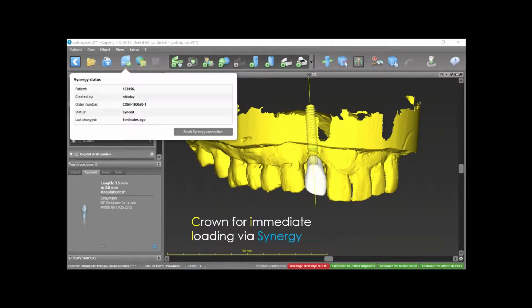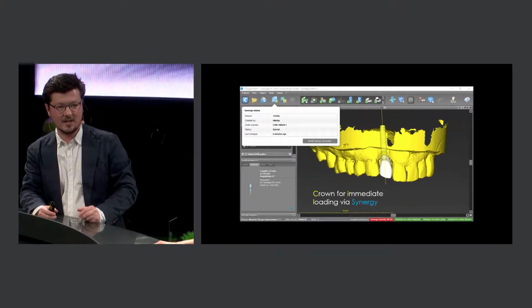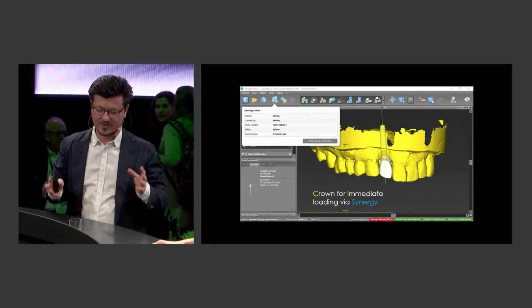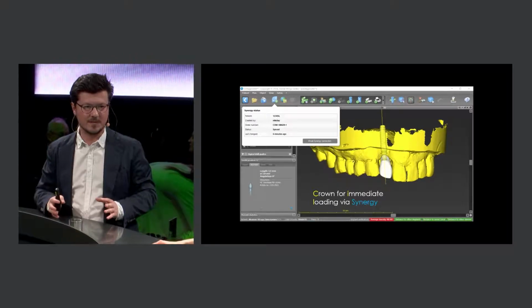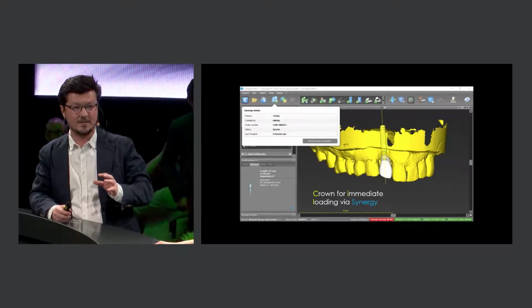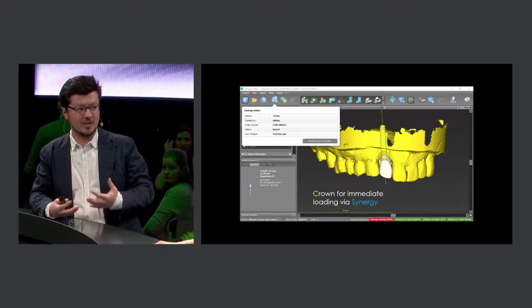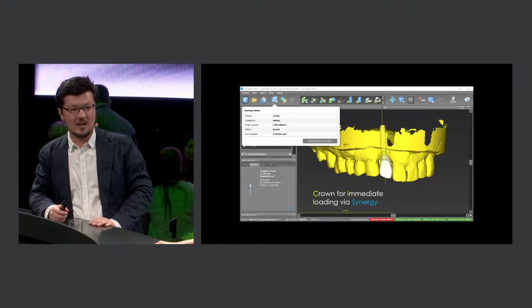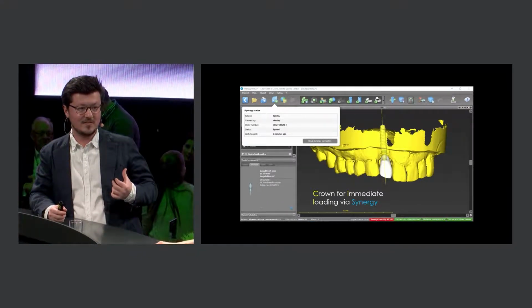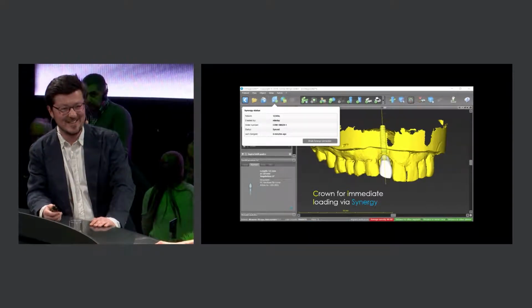We can do it by sending him STL files, so the matching is done by these STL files. We also send him antagonists, the bite, everything so that he can create interproximal contacts, occlusion, and check everything. This is done live, so any changes that he makes, I can see live. I can see him working on the crown, and he can see my implant if I change its position. In my case, I was doing this patient in Moscow, and my dental technician is in Italy, so we can do it even from different countries. The digital world is a good place today.